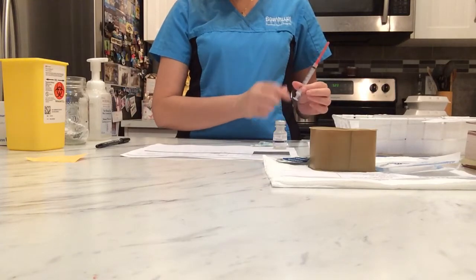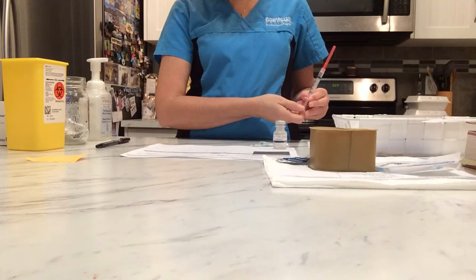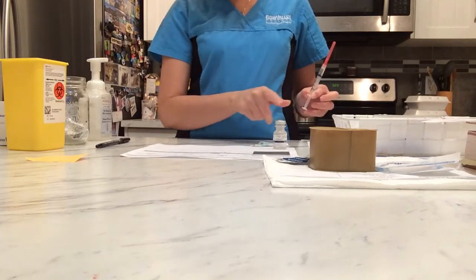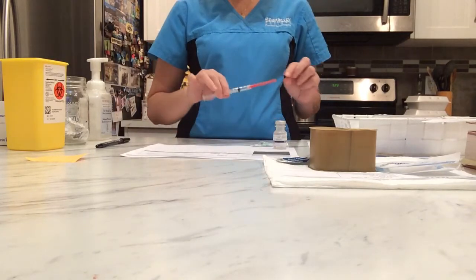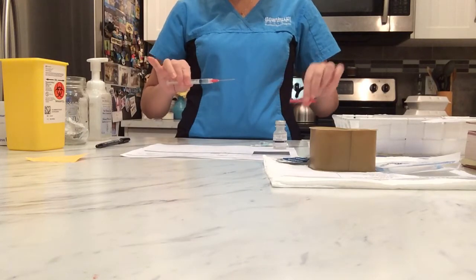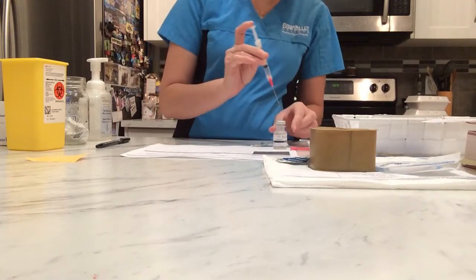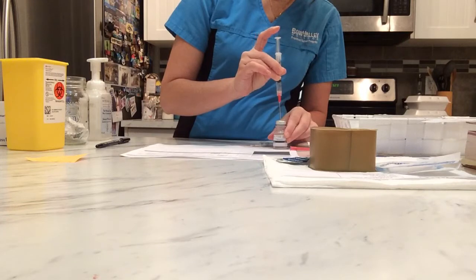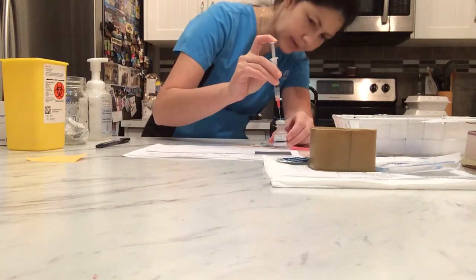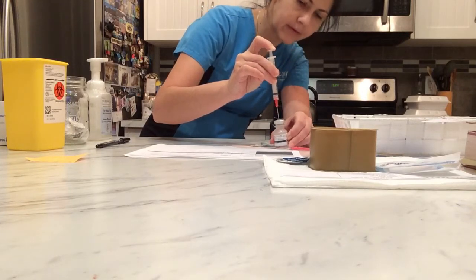And now I'm gonna draw some air into my syringe. I'm gonna put the same amount of air that I'm going to withdraw from the vial. Okay, I have 1. I'm gonna put some air first.